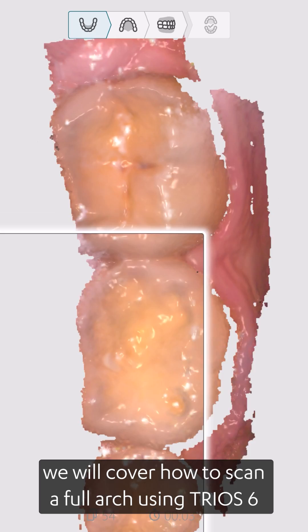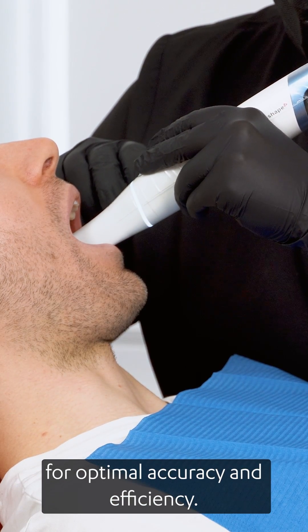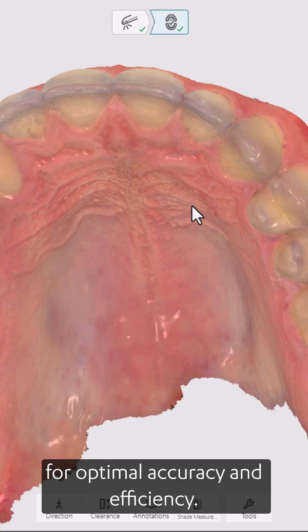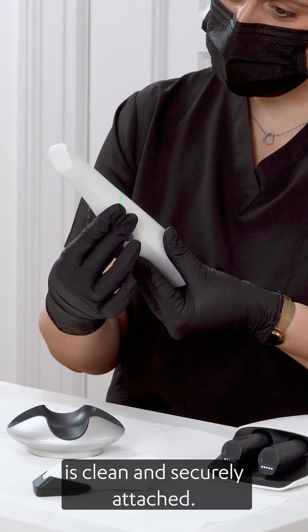In this video, we will cover how to scan a full arch using TRIOS for optimal accuracy and efficiency. Before scanning, ensure that the scanner tip is clean and securely attached.